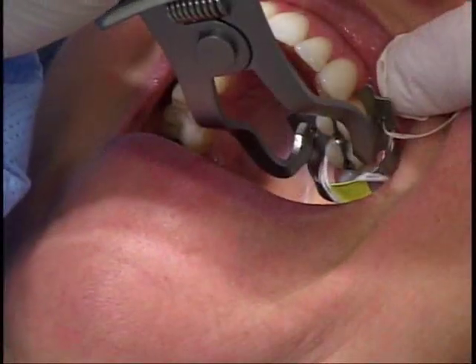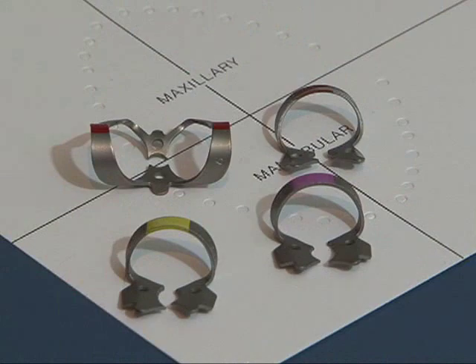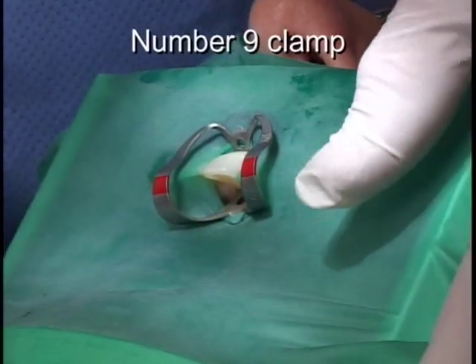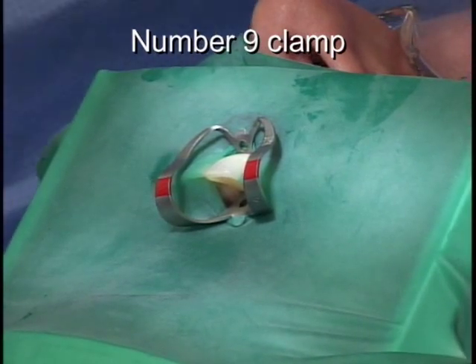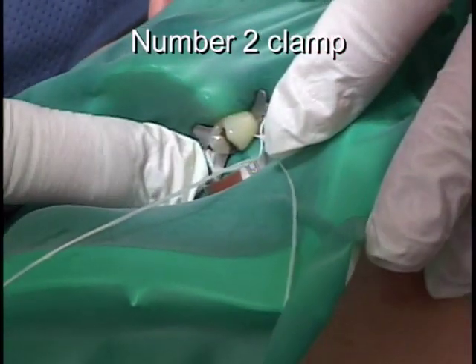The tooth that receives the clamp is called the anchor tooth. The Simple Clamp Kit contains the most widely used clamps. The number nine clamp is used for anterior teeth for endodontic therapy. The number two is the most popular premolar clamp for both upper and lower teeth.